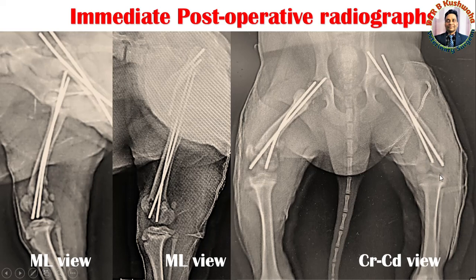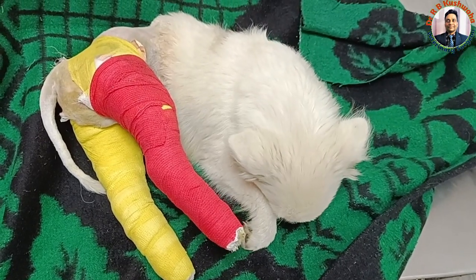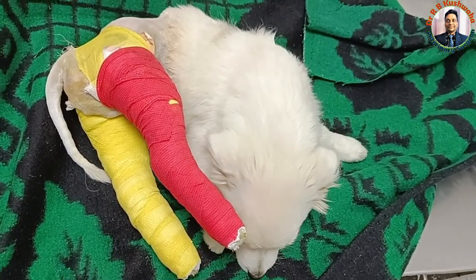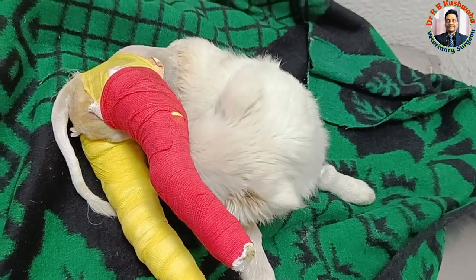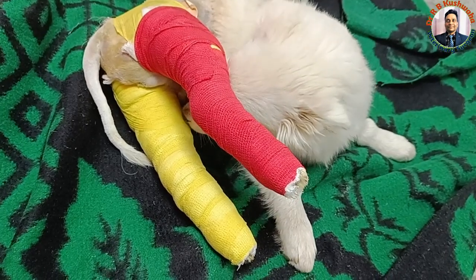Since this was taken in the craniocaudal view, there is angulation of the femur relative to the X-ray beam — so the portion outside the trochanteric fossa appears very long, but it is not actually. On the left side, the alignment of the medial cortex is in alignment with the condyle, and the lateral side is also in alignment. Regarding post-operative medication, this is a routine one: antibiotics, analgesics, and other supportive treatment.